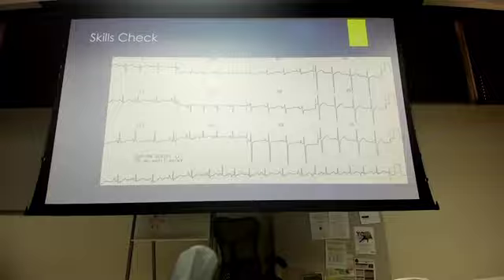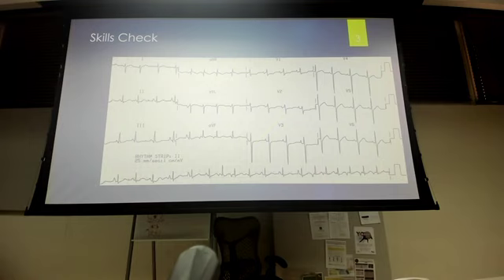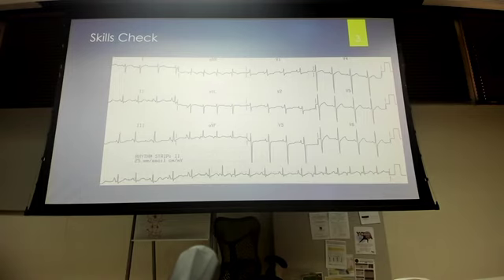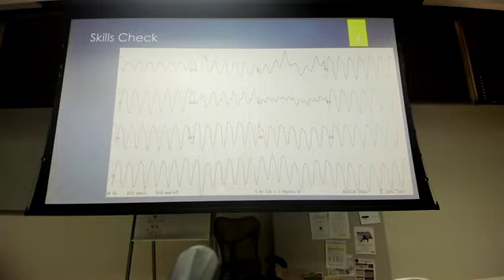If you were to be given a scenario, what's going to be the underlying problem for this patient? Something respiratory. COPD, bad pneumonia, hypoxia. Something respiratory is what's causing this. You fix that underlying respiratory issue, guess what? Their EKG goes back to not multifocal atrial tachycardia. It might still be tachycardia, but you're going to fix those multiple foci that are firing in the atria. Those are going to be calmed down, and now the SA node can continue taking over. Right, so very good. Multifocal atrial tachycardia.